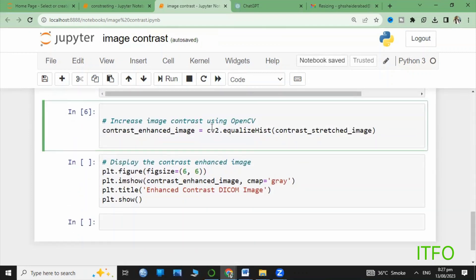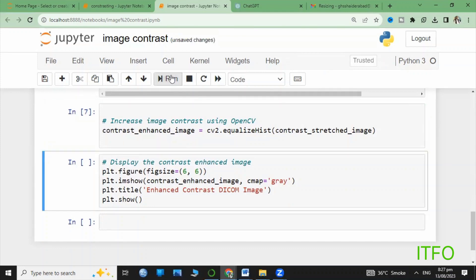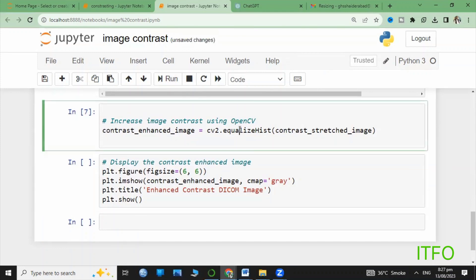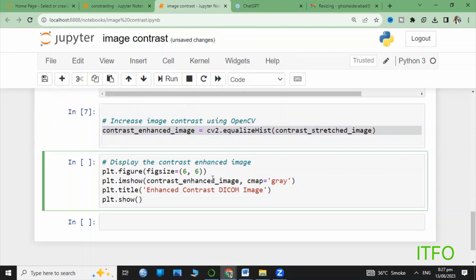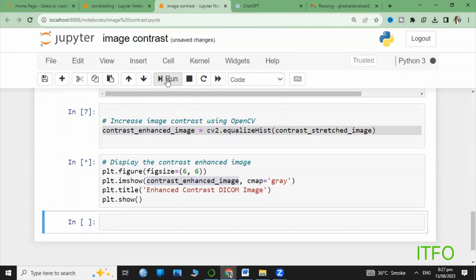Now going for displaying the contrast stretched images. Let's visualize the image after applying the contrast stretching to enhance its contrast. Here you can see the code is as for the original image stretching.